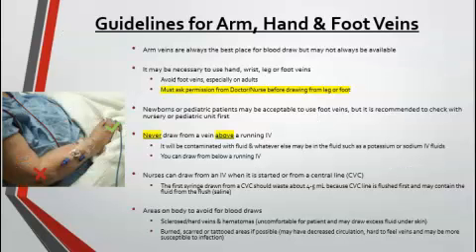Next, we need to cover some guidelines of collection of blood from the arm, the hand, and foot veins. The veins of the arms are always the best place to complete blood draws, but they're not always an option for one reason or another.